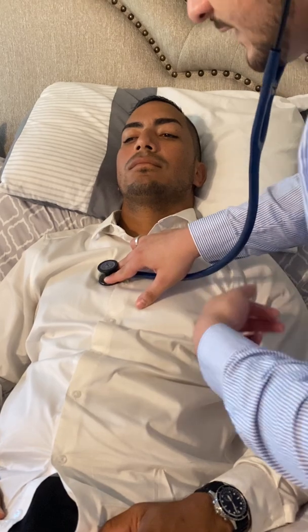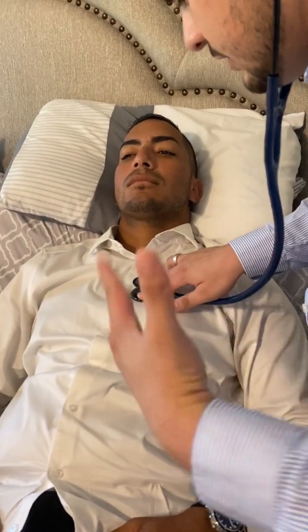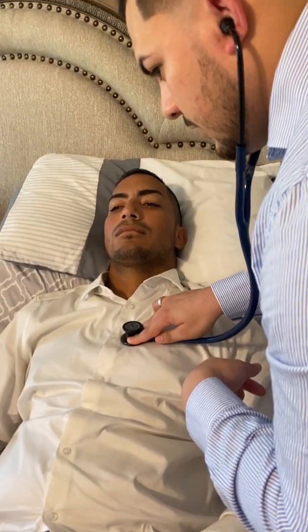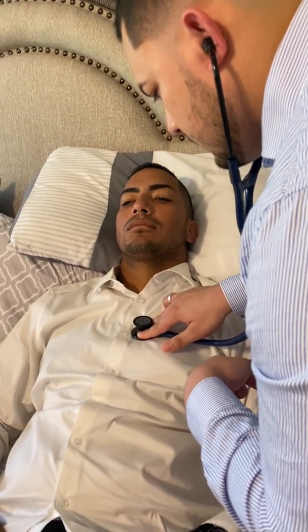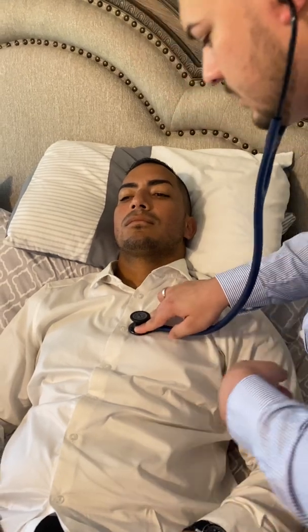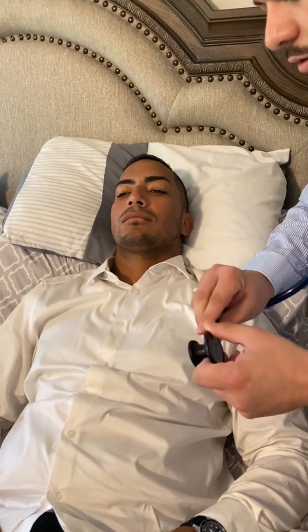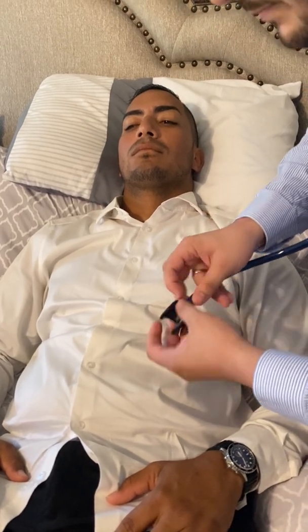Now it's gonna be the second intercostal space to his left, and that's gonna be his pulmonary valve. Very good. Now then the third intercostal space is Erb's point, and there you would use the bell to check for any pericardial friction rub. No pericardial friction rub noted.